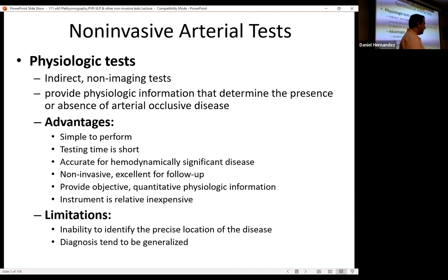It's a lot easier to perform and a lot less tedious than having to do an arterial duplex, what we're going to be doing after this, where we actually have to image each artery going down the leg, looking for specific areas of stenosis. That could be quite time consuming, quite challenging, whereas we can just, even if we want to, do an ankle brachial on this instead of even bothering with all the cuffs, just see what's going on by each ankle, that can kind of give us a quick baseline.